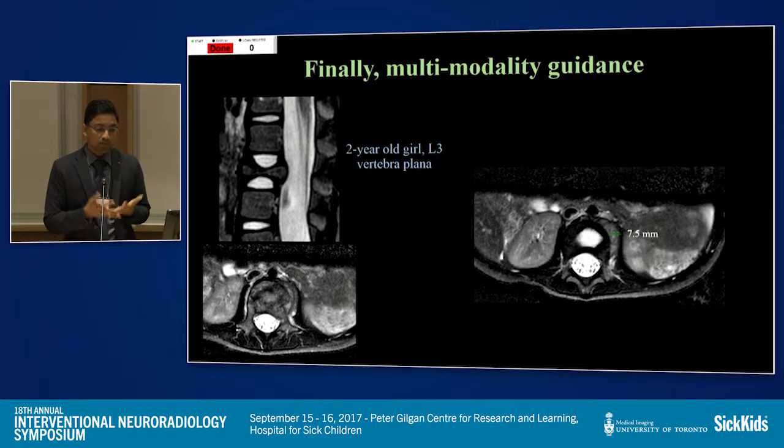When the soft tissue, even when we mag it up, it's not even a centimeter. So even when you mag it up, it looks small. A standard posterolateral approach is usually not possible at this age because the psoas muscle has not yet developed and you don't have tissue to go through. Now these are examples where we would use information from a number of modalities.